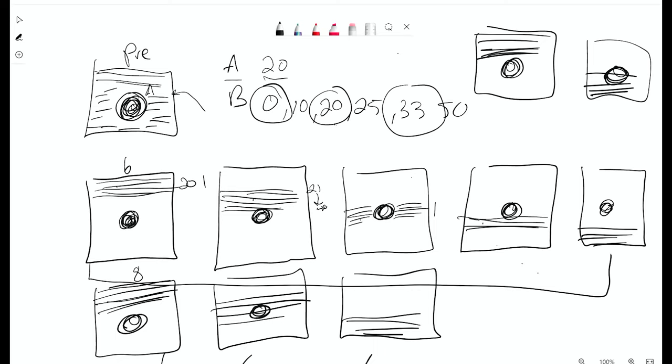Right. And something also to keep in mind on the TRICKS or TWIST sequence is that a lot of times what we're really trying to do is get what's called the time MIP. Have you ever seen that? Yeah. It's really important. You can actually have a movie that shows the filling phase of every single phase. Right. Because it's really important that you do that, because then you can choose inside that movie which one you want to actually MIP.